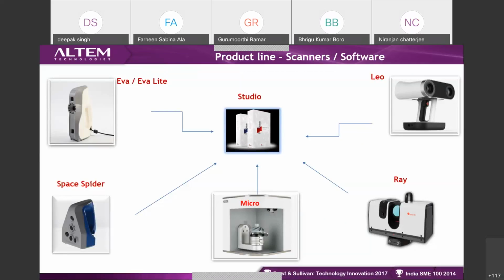Okay. The reflection will be captured by the sensor, and those sensors will generate a point in the software. So it is very similar to how our eyes work. Wherever light can go and reflect back, only those areas will be captured, and nothing else. This is not like a CT scan. This is very different from a CT scan. A CT scan works by penetration. Here, this works by reflection.